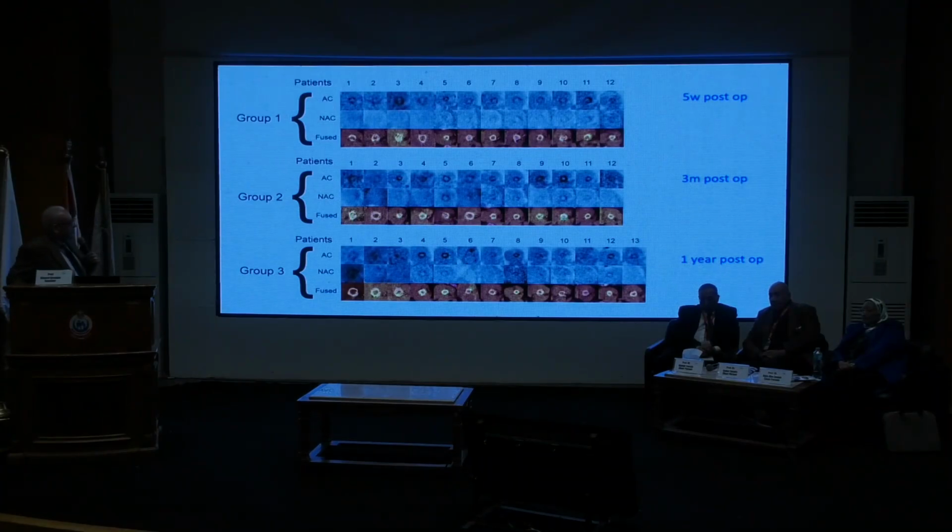Here we can see that all cases have uptake in the AC image, but few cases have uptake in the non-AC image. This is why evaluation of the non-AC image is very important in evaluation of suspected infective endocarditis.